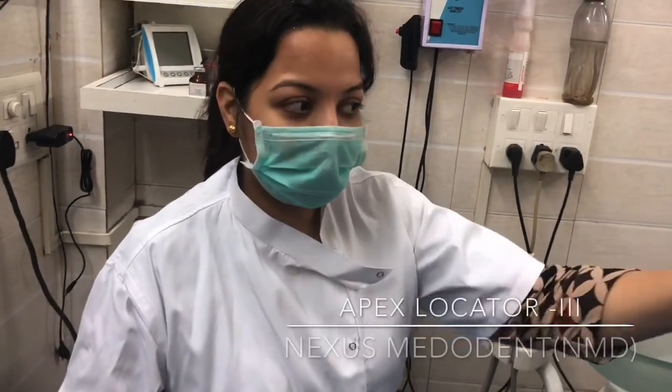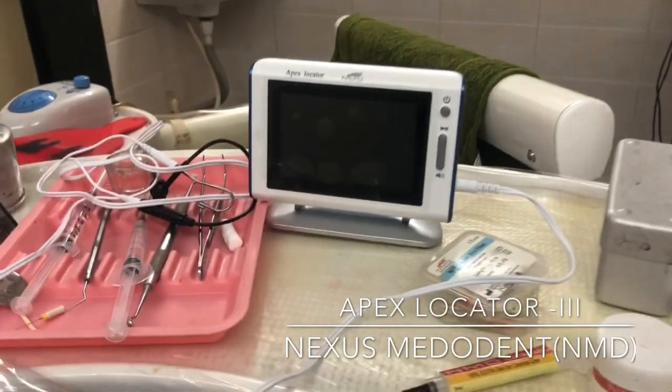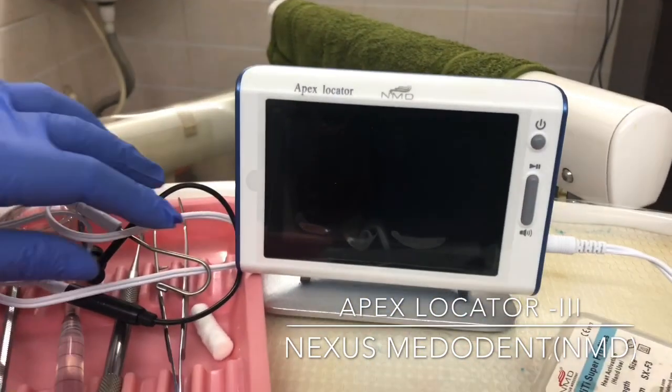Hello friends, today I will be showing you this Apex Locator from NMD Nexus Medodent. Let's check out how it gives us the reading.